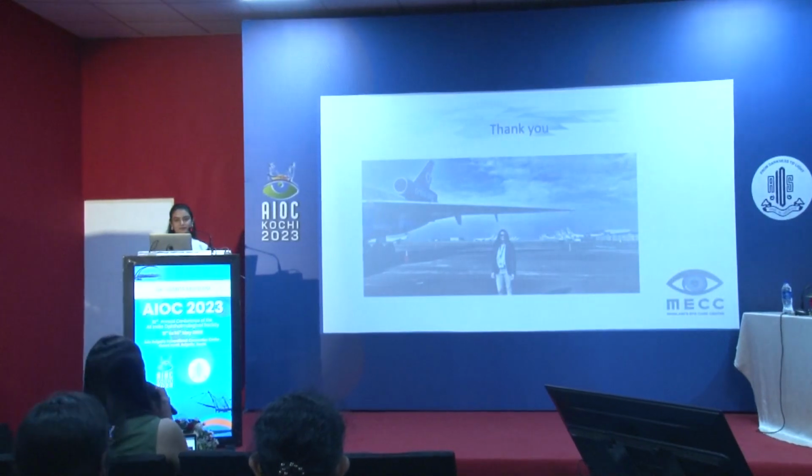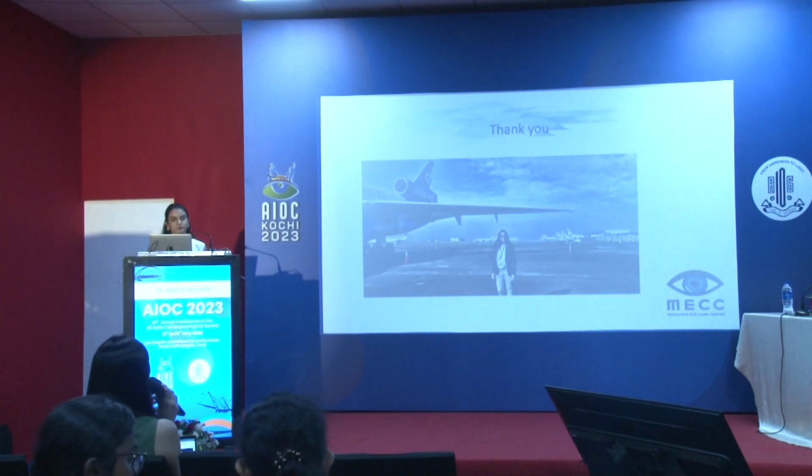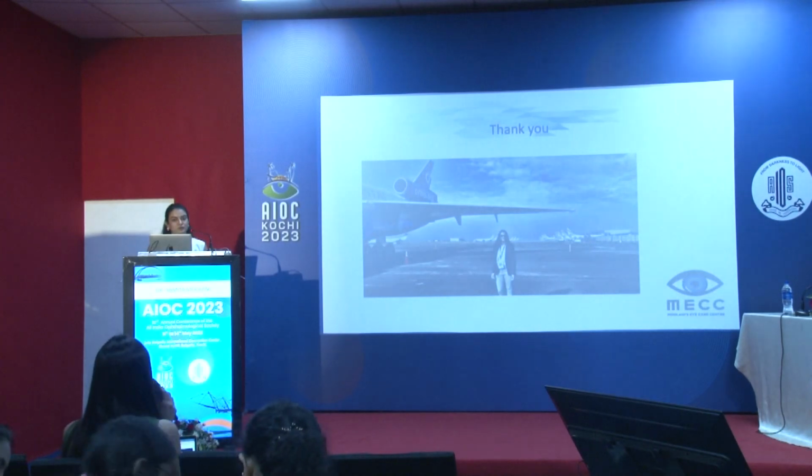Yeah. Another pointer I also wanted to make is that in post LASIK, because we are going to see more and more patients post LASIK, I don't think you can give up the idea of multifocal totally on them. They do well as long as you're getting good readings, good values on EKR, and it's a central ablation. These patients actually do really well with your trifocal IOLs also. I mean, that's been my experience.